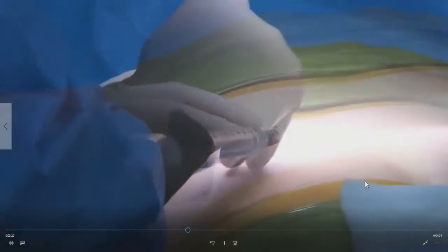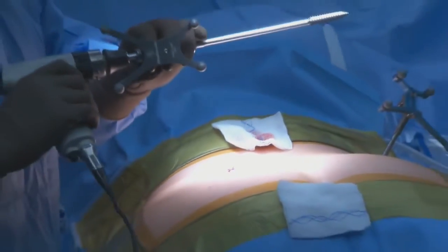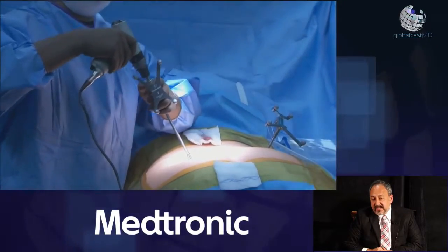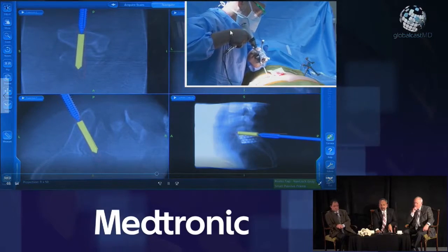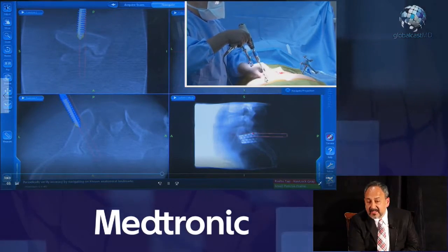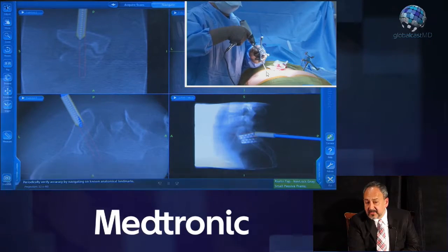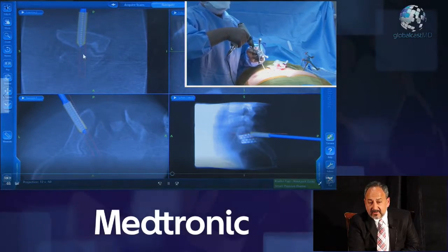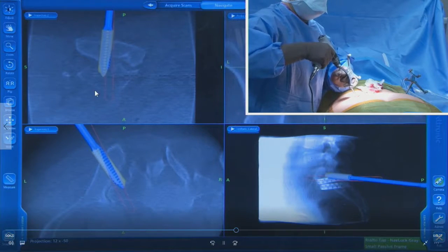I'm putting in a little bit of local anesthetic. We'll use a 15-blade knife to make a small incision — probably less than two centimeters — through which we can work. This is our sharp tap, and it's powered so that we don't need to pound it with a mallet. There's no muscle there; we'll be thrashing through some fat, but that's about it. And we're following our track down across the sacroiliac joint. You can feel the cortices as you pass through them, which is very helpful.